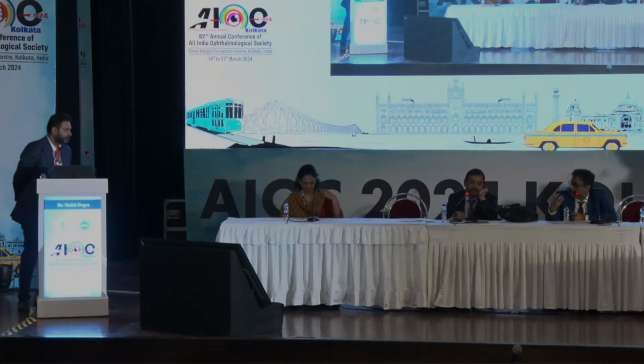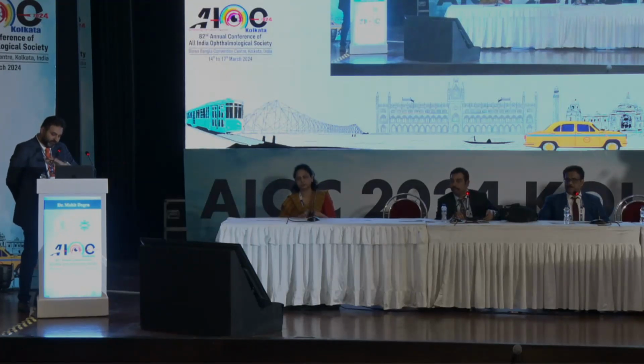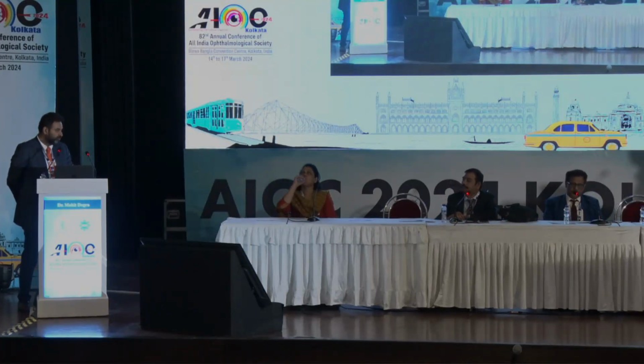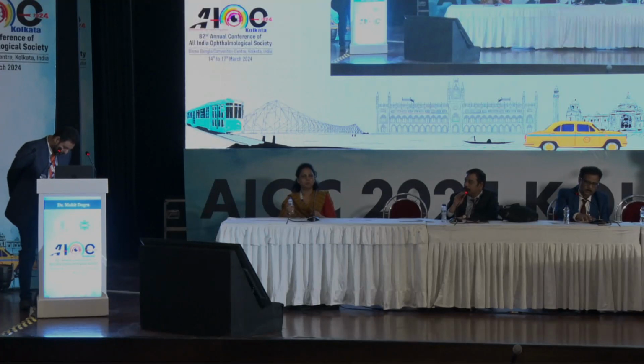And also the 3D structure of the image, the 3D perception of the whole system of the fundus, whether any traction is visible or not, that is not visible in a 2D picture of Optos. Yeah, for vitreous, absolutely. For the vitreoretinal interface or for vitreous visualization, with ultra wide field, I think the resolution is exquisitely poor for us to comment on that. Right. Yeah, I think you have just answered most of the things.